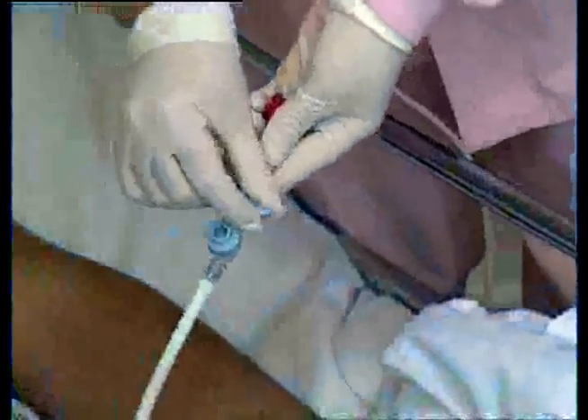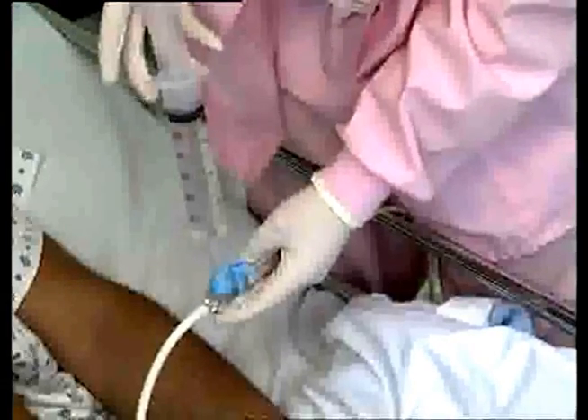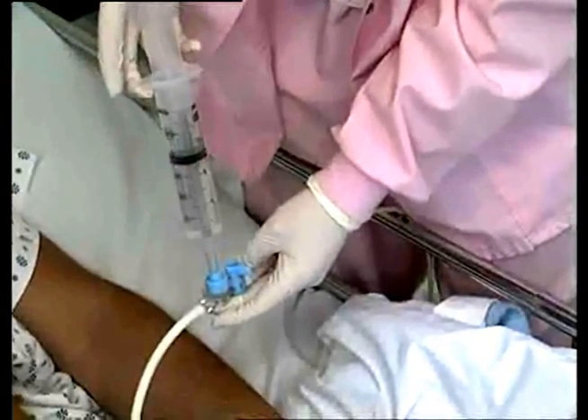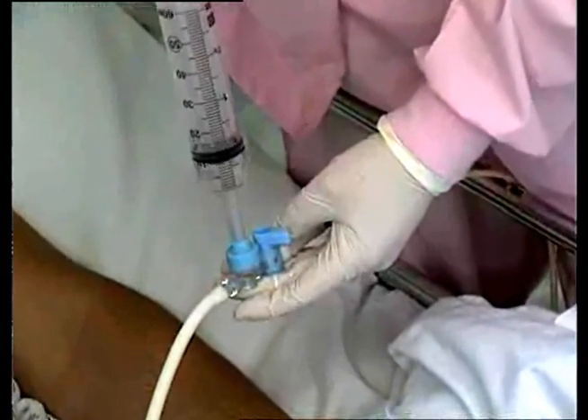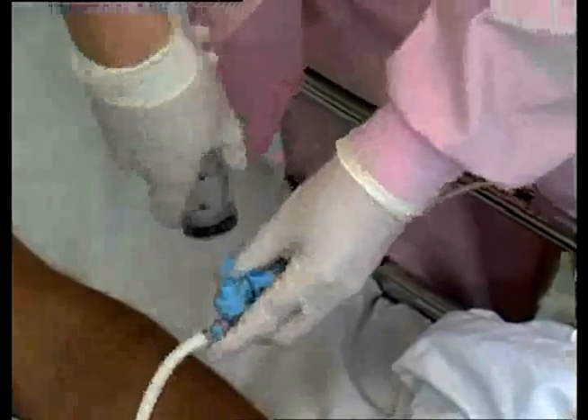Turn the handle on the ACE Connector to the off position. While holding the ACE Connector firmly, push and twist the catheter tip syringe into the auto-seal syringe port until it is tight. Dispense medication into the ACE Connector. When you remove the syringe, the auto-seal syringe port will close automatically.